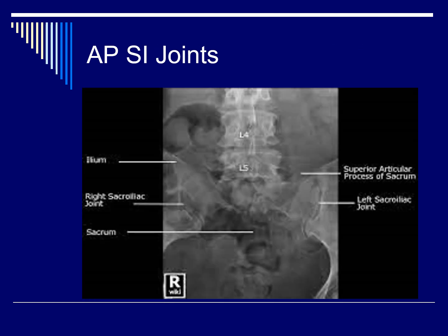So here's a radiograph of the AP axial SI joints. You should see the sacrum in the center of the pelvis. You should also note the spinous processes are going to be in the center on L4, L5. You should see the SI joints partially open and have about 1 inch on either side of the ilium included on the radiograph. You do not need to see the entire sacrum because this is just for the SI joints. That 30 to 35 degree cephalic angle helps to open up or elongate the SI joints for a better view for the radiologist.